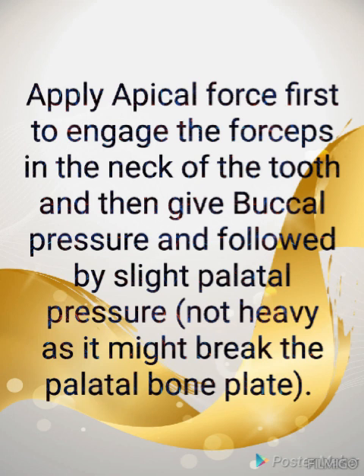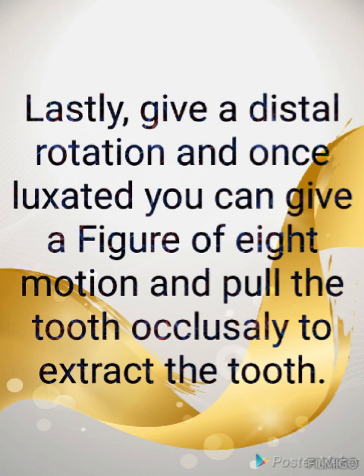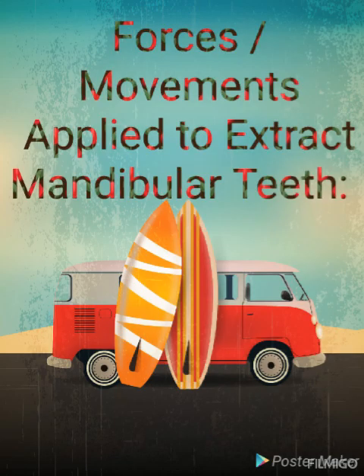Apply apical force first to engage the forceps in the neck of the tooth, then give buccal pressure, followed by slight palatal pressure, not heavy as it might break the palatal bone. So slight palatal pressure and lastly give a distal rotation. Here it is very important, distal rotation. And once luxated, you can give a figure of 8 motion and pull the tooth occlusally to extract the tooth.